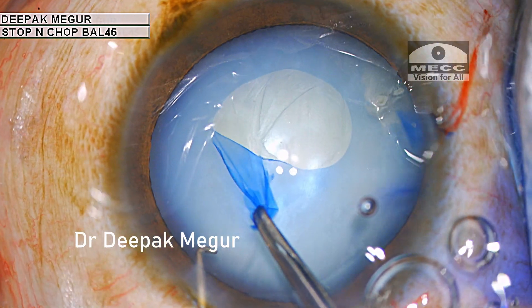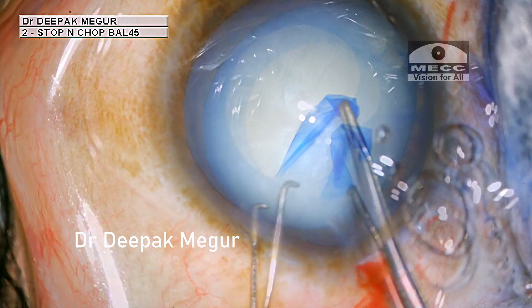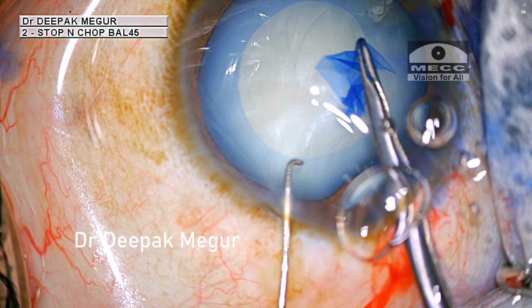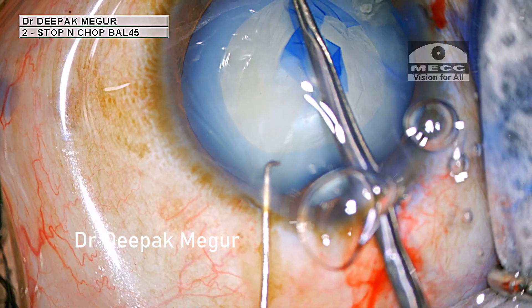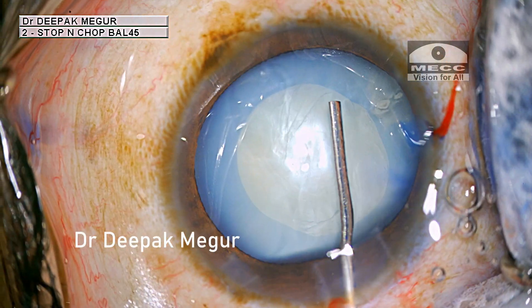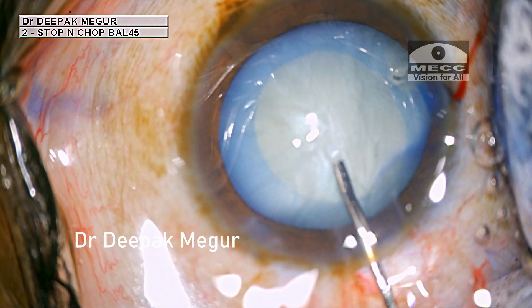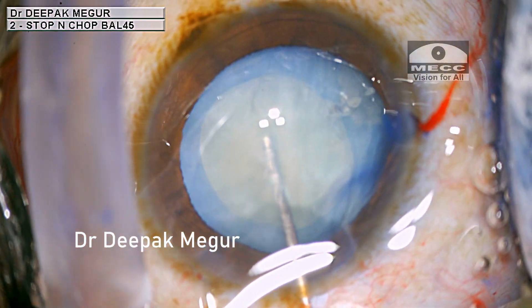The case looks straightforward and at this point I did not expect anything unusual during the surgery. I begin my rhexis, aiming for around a 5 millimeter size. I'm careful to avoid the area of the calcified speck. I don't aim to do full hydrodissection, but I just want to loosen the lens a little bit and confirm that the area of the calcified capsule is not holding on to the underlying nucleus.